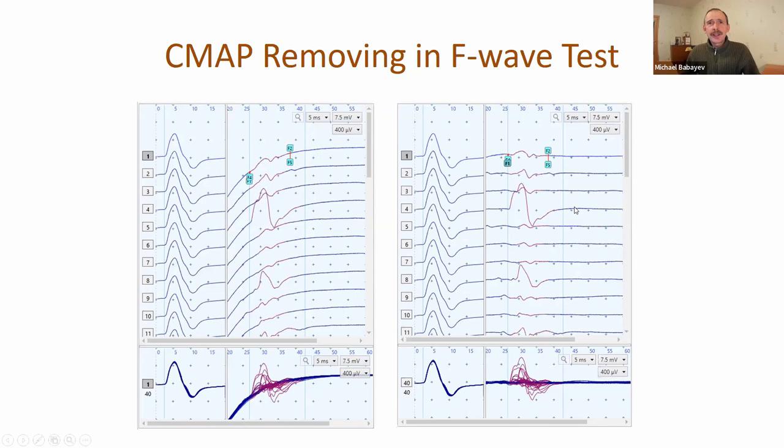At any time it's possible to toggle between these two views because the source traces are saved in the examination and can be made visible at any time. Moreover, you can change the settings so that just after acquisition you will go directly to this cleaned view.